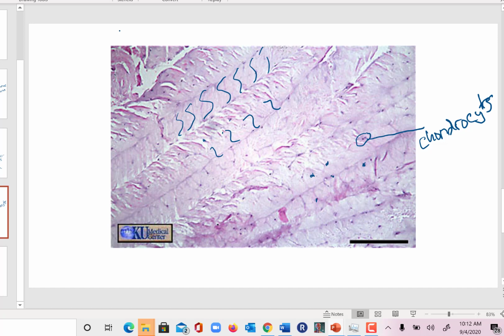The densely interwoven collagen fibers contribute to the extreme durability of this type of cartilage. It has no perichondrium because stress applied at the surface of the fibrocartilage would easily destroy that tissue layer. Fibrocartilage is found in the intervertebral discs, the pubic symphysis, and the menisci of the knee joint. It acts as a shock absorber, and resists compression and pulling forces, or tension forces.